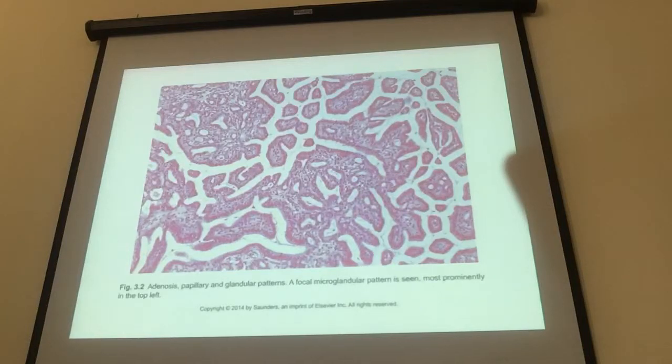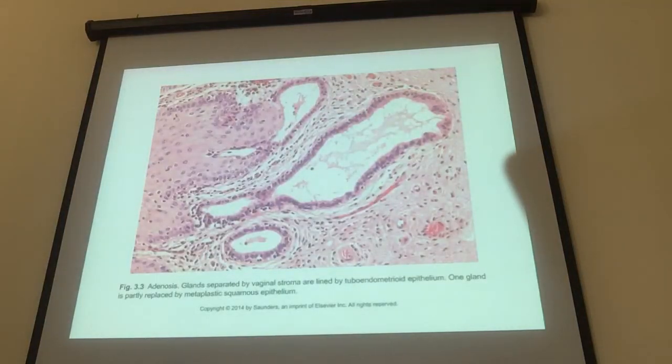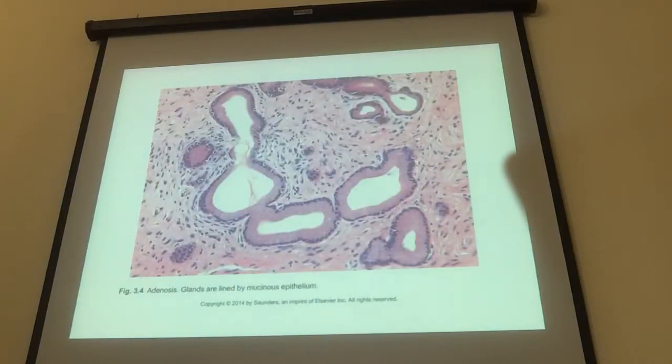very low nuclear to cytoplasmic ratios. And usually, as I said, it's beneath the squamous mucosa that you have this. So it looks like maybe endocervix with squamous metaplasia a lot. So the differential can include things like ectopic cervix or duplication of the cervix sometimes. You have to know where the biopsy is coming from.